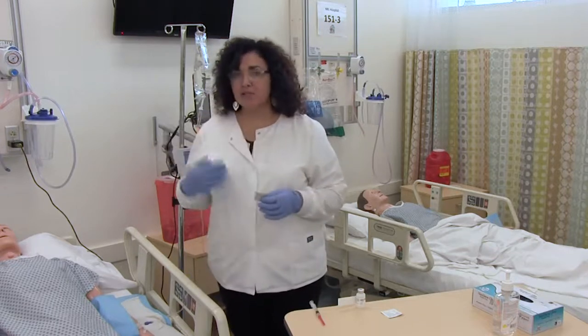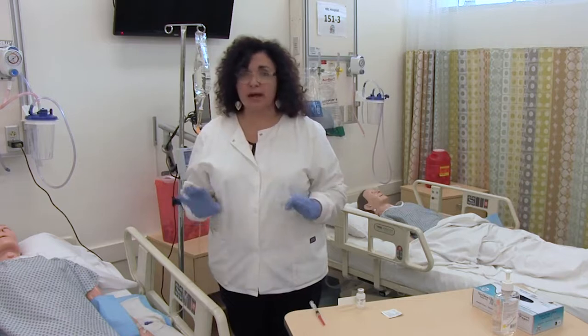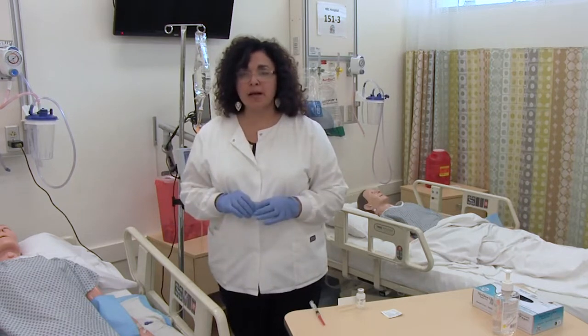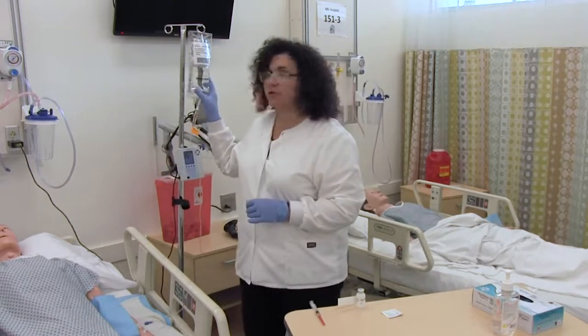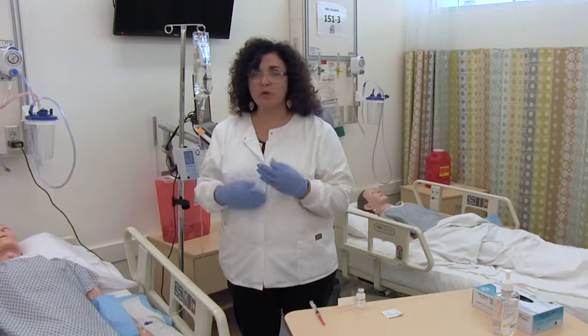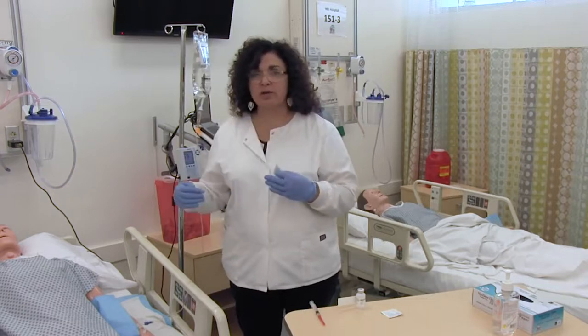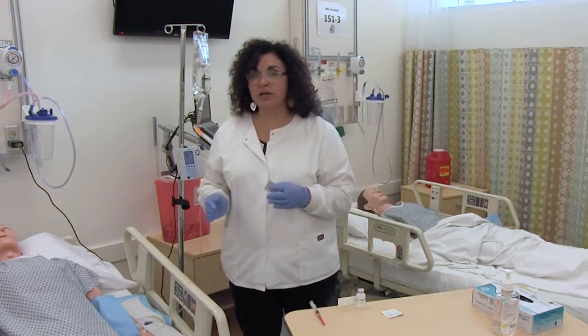In this instance, when we're going through the primary line, there's no need for any flushes. Because really, the primary fluid that's compatible is serving as a pre-flush and a post-flush. That's transporting the medication into the bloodstream as I'm pushing it, so no need for flushes.